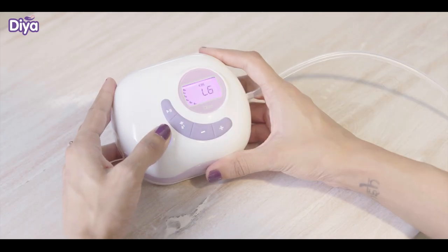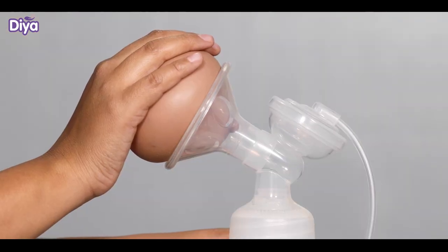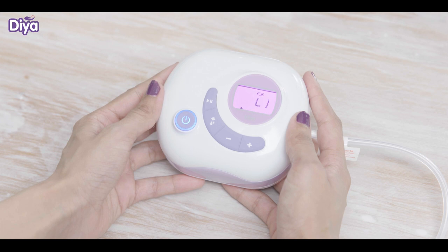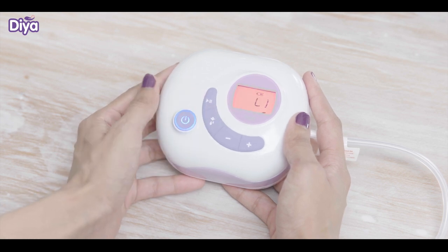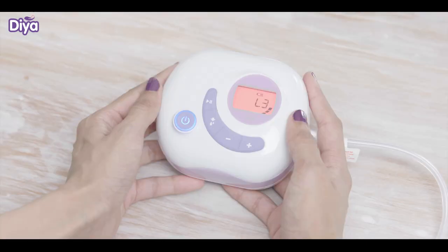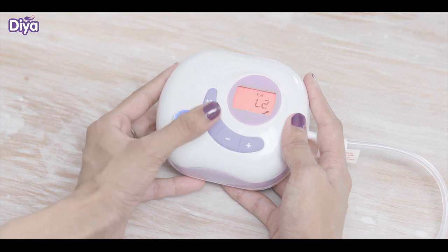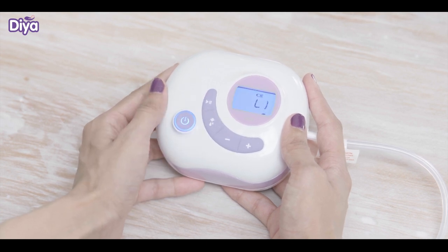Press the on-off button. Stimulation mode will start with purple light. You can control the suction level from the motor unit. After one to two minutes, press the switch button to change to the recommended expression mode for deep suction. You will see the color change to red. For power expression mode, press the switch button again and the blue light will turn on.